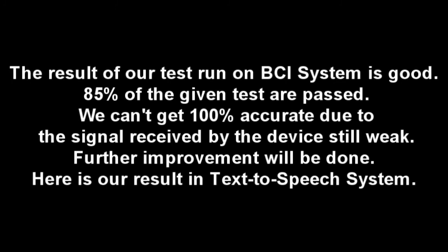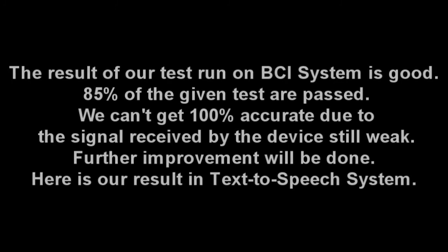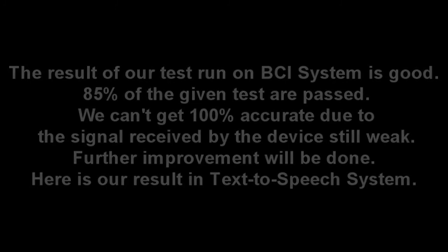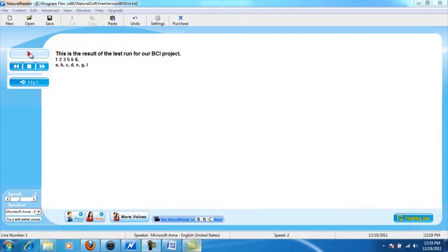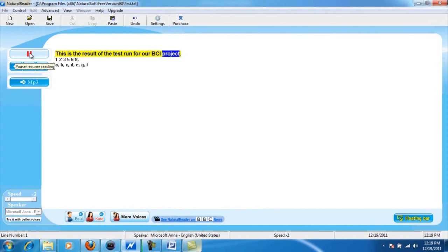Here are our results in the text-to-speech system. This is the result of the test run for our BCI project: 1, 2, 3, 5, 6, 8. A, B, C, D, E, G, I.